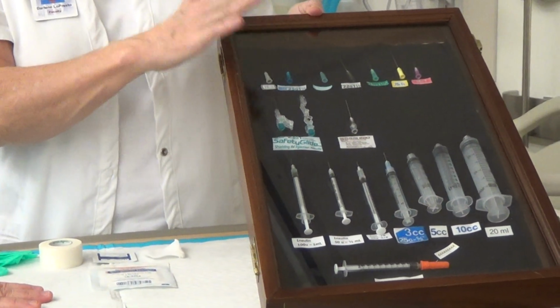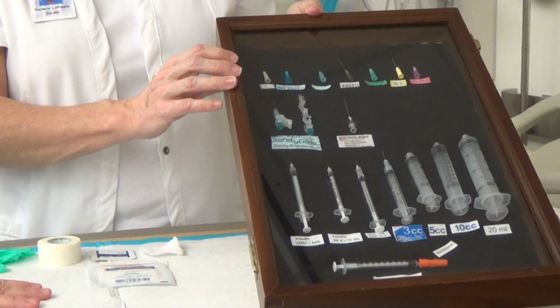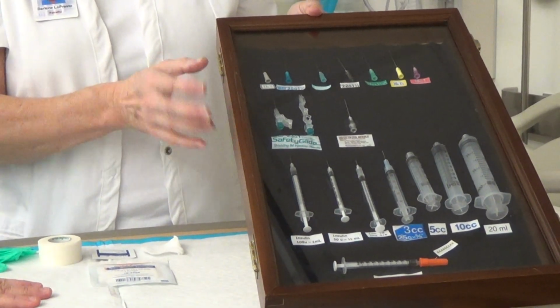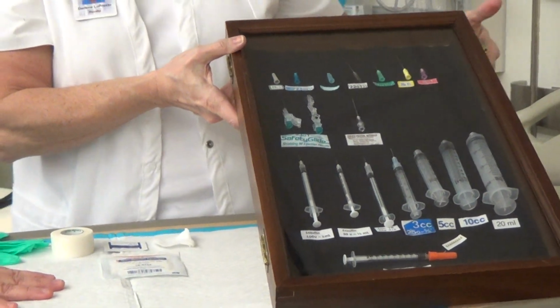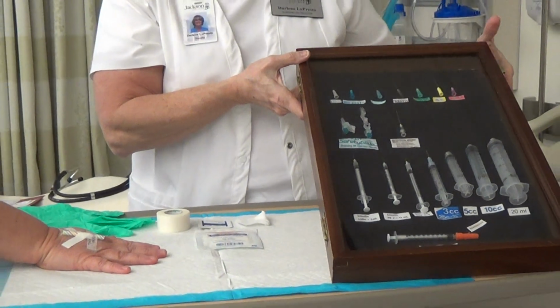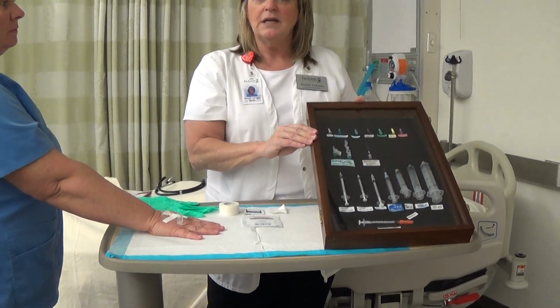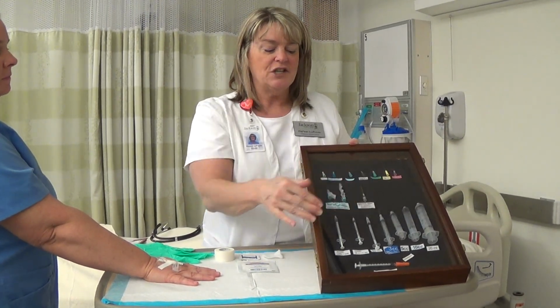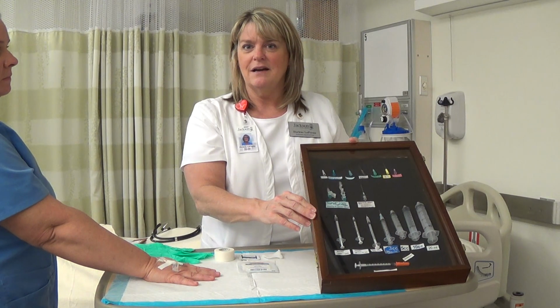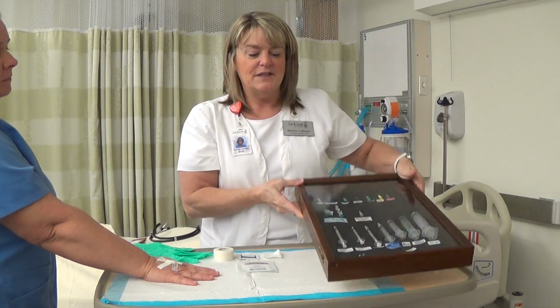And you don't have to learn that now, but in clinicals we'll be asking you to start learning the different sizes and the different shapes, because as an LPN you cannot insert these in the state of Michigan unless you are specially trained, and we do not do that here at Jackson College. So your scope of practice only covers discontinuing the IV site. And then the bottom of the shadow box just shows you all the different sizes of syringes that you'll be working with and encountering in the healthcare facilities.